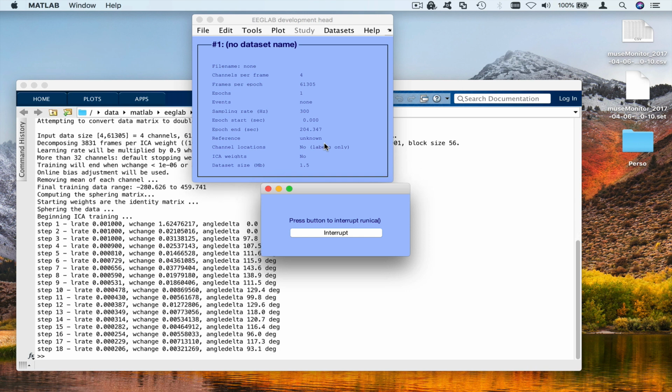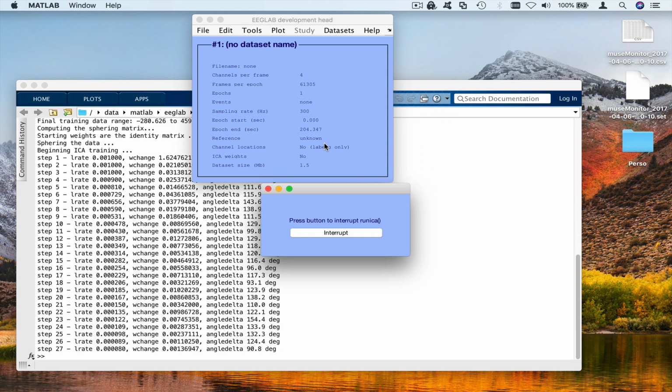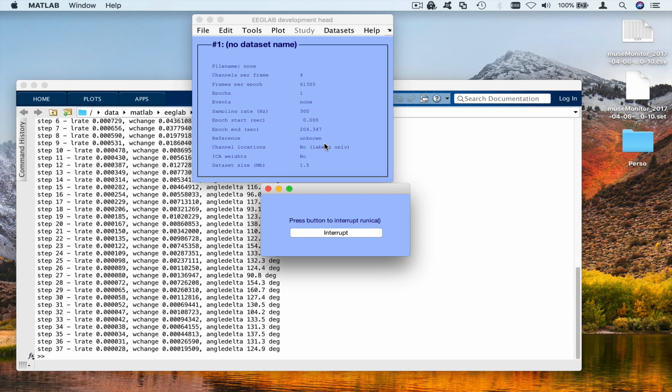I remove extended because it takes a long time. Although in that case, it might be relevant. You don't have to remove extended. You can keep extended.